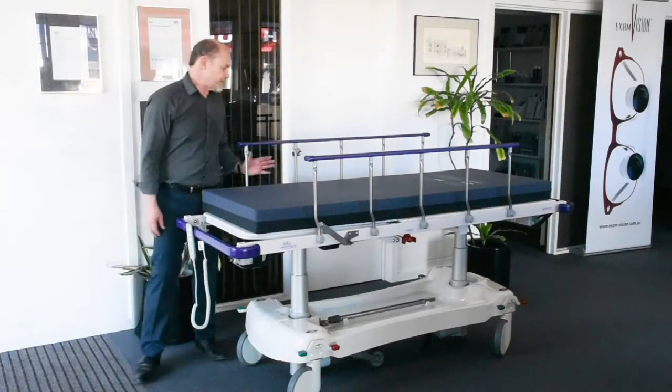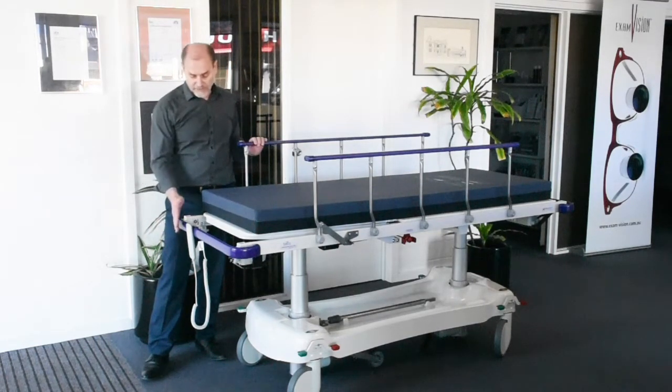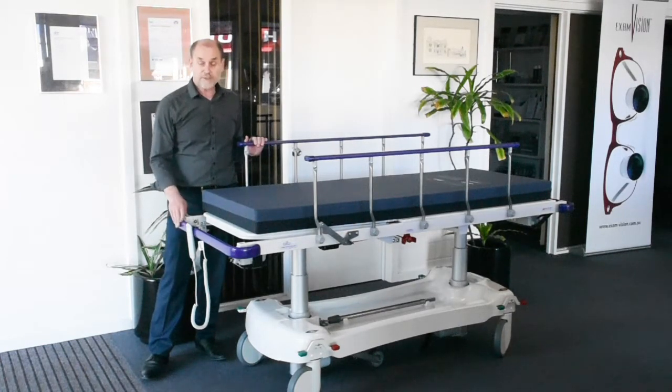It has the standard dropside configuration with five risers, but there are other configurations including split drop sides. The colour of the handrails and end rails can be chosen from a palette of seven colours — this one is purple.